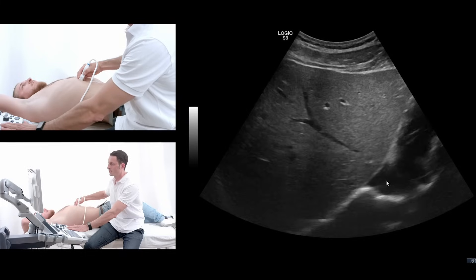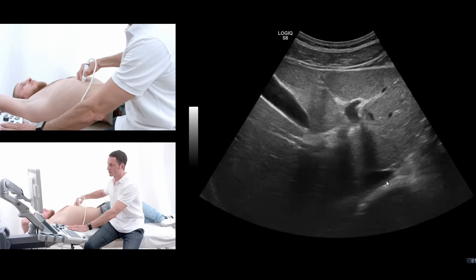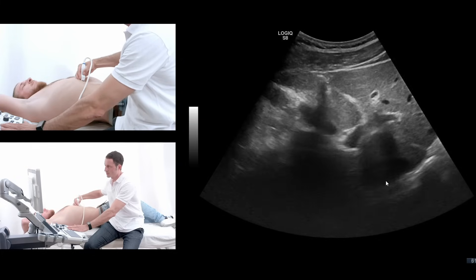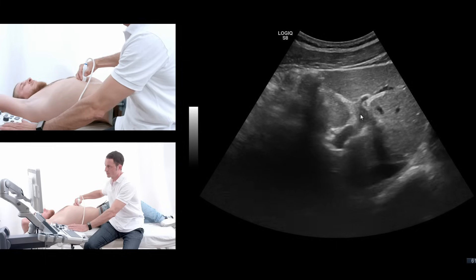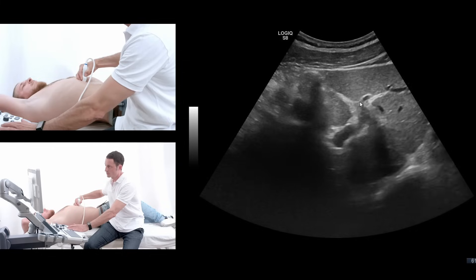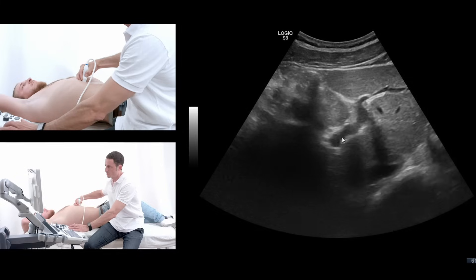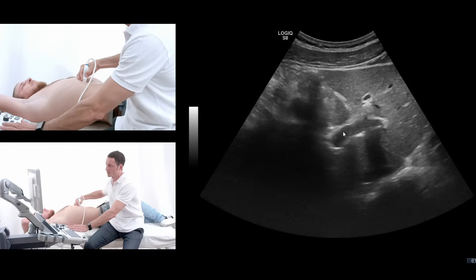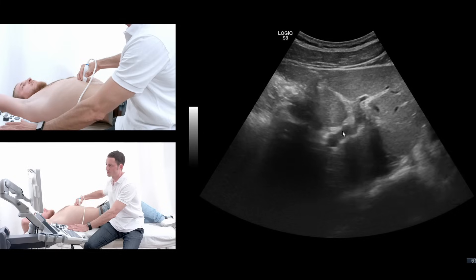Take a deep breath and hold it. The next cross section is the jumping stag sign. As you can see here, you can see like the horns on the head of the stag, then you can see the body, the legs going away, which is the portal vein branching in the center of the liver.